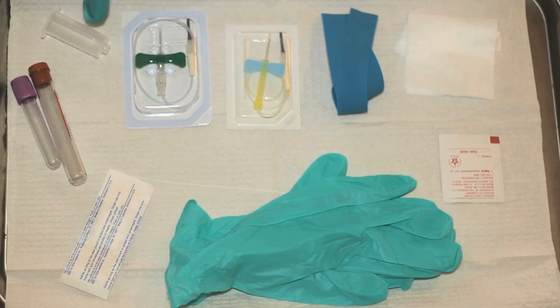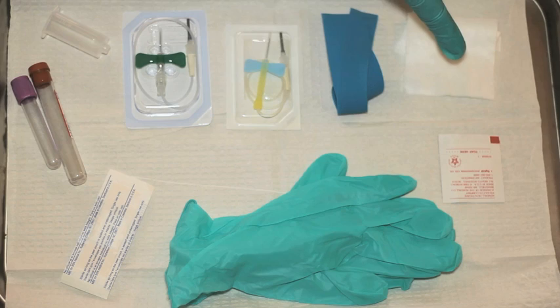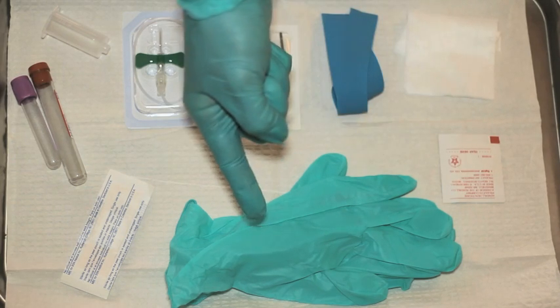This includes vacutainer tubes with an adapter, a 21 or 23 gauge butterfly needle, a tourniquet, gauze, alcohol swabs, gloves, and a band-aid.